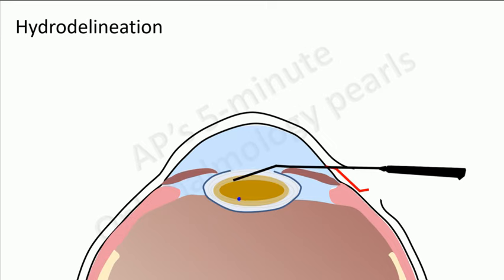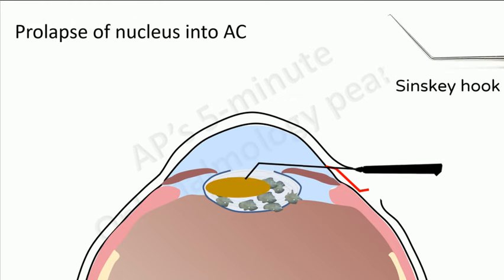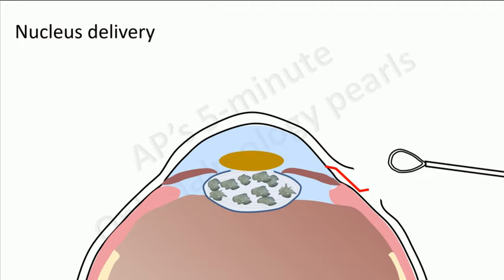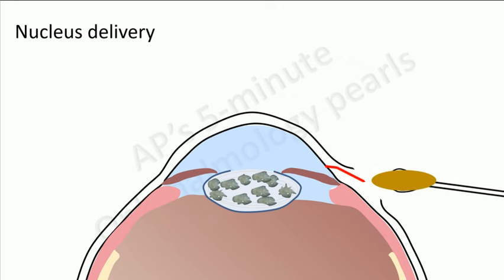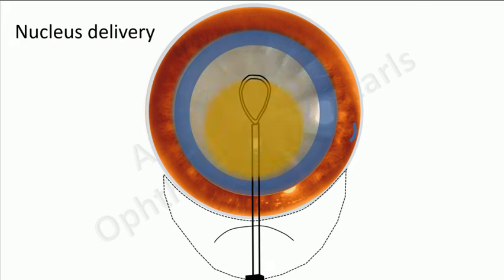In hydrodelineation, balanced salt solution is injected into the mass of the nucleus to separate the soft epinucleus from the harder inner main nucleus. The nucleus is then prolapsed into the anterior chamber using a Sinskey hook. The nucleus is then removed from the eye with the help of a wire vectis. You can see the same thing in the operating view.